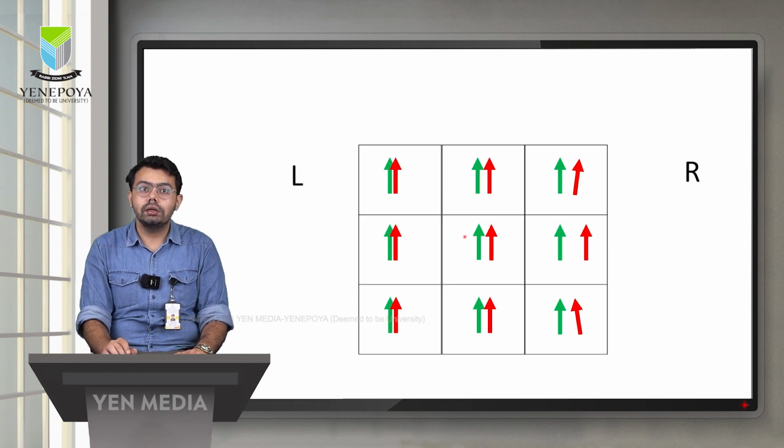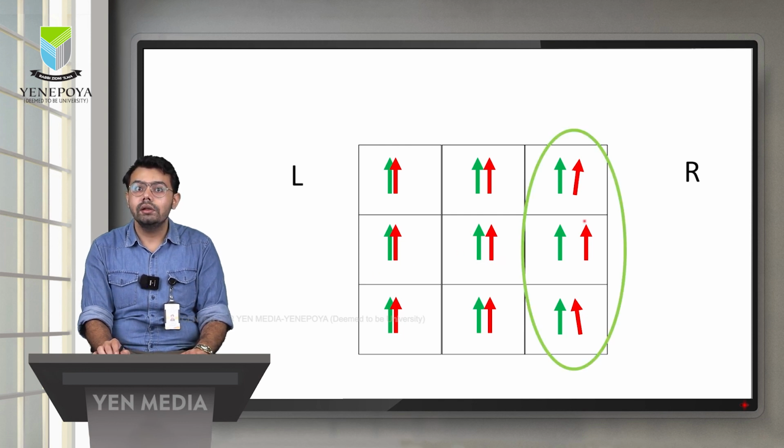So coming to the diplopia chart interpretation, first we see that this is the right side, this is the left side. On the right side, we are giving the red glasses. So the image of the right is falling on the right, the left is falling on the left. So this is an uncrossed diplopia. Second, we have to find out which position has the maximum separation of image.